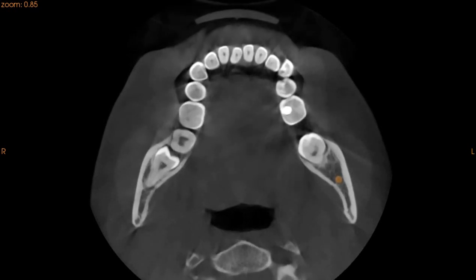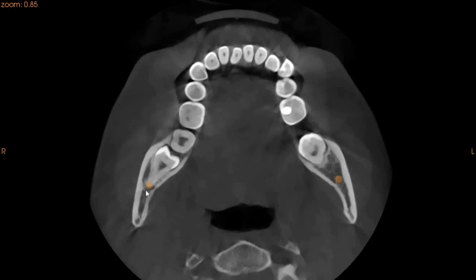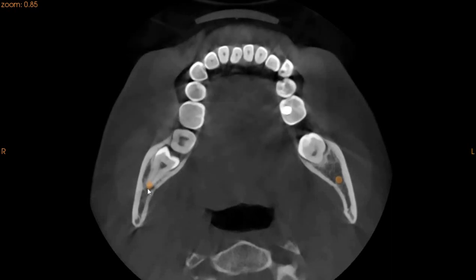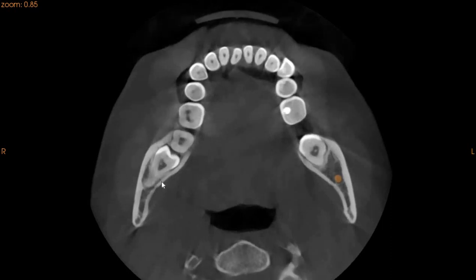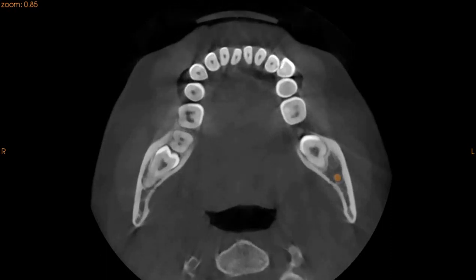Here you can also see the compression right here. Turning the nerve tracing on — this part is where the nerve gets compressed by the apex of the lower right wisdom tooth.